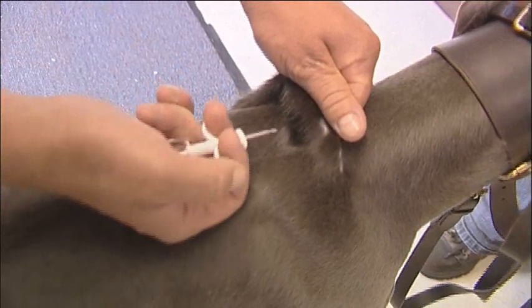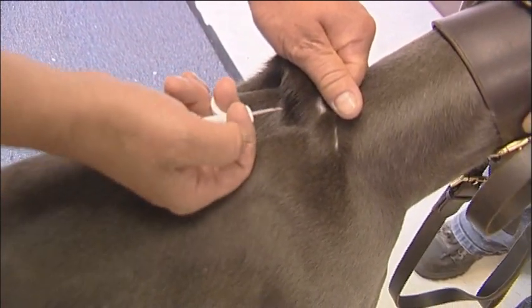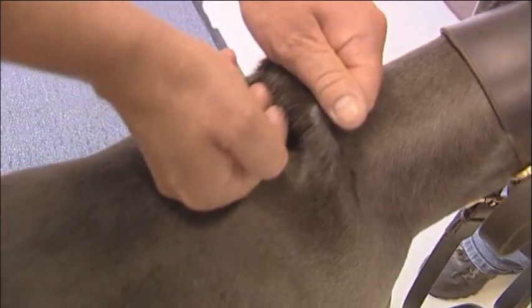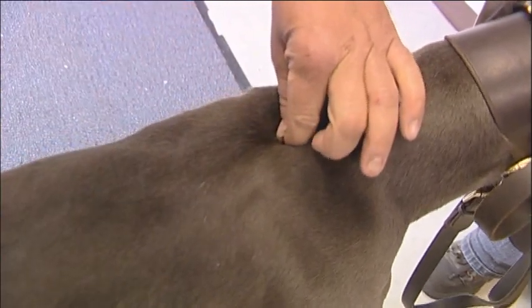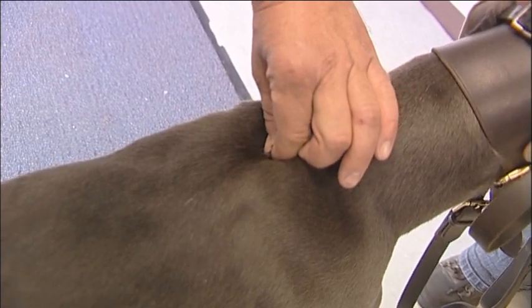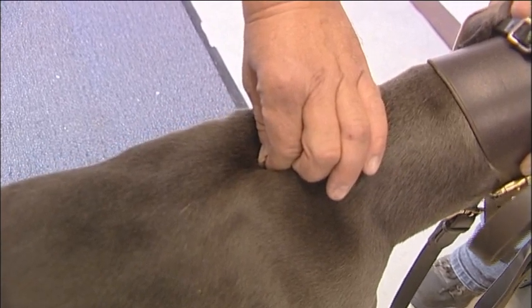With the scruff of the neck in one hand and the bevel of the needle pointing upwards, rest the back of your hand against the back of the greyhound. Smoothly insert the needle level with the back of the greyhound. Next, depress the plunger to insert the microchip when the needle is fully into the scruff. It's a good idea to keep pressure on the area of the microchip insertion for about 30 seconds when withdrawing the needle.